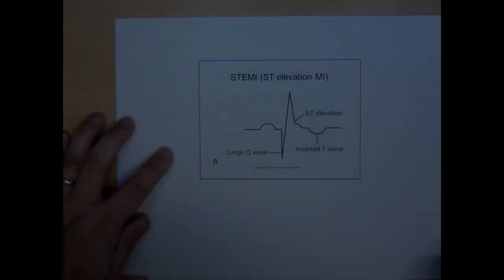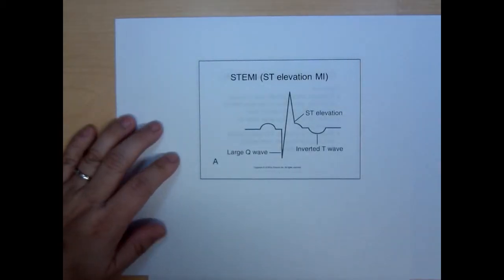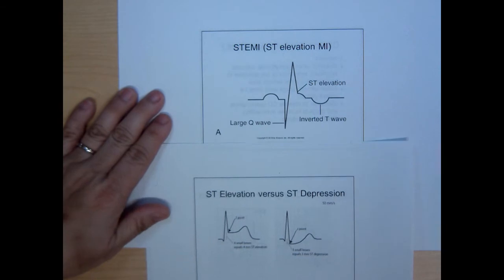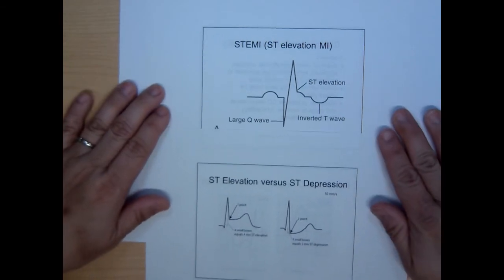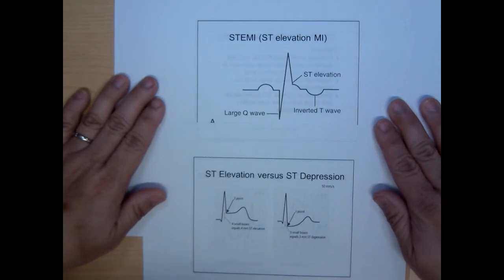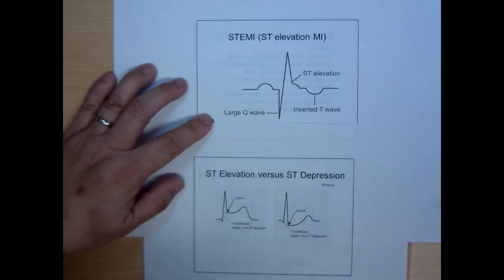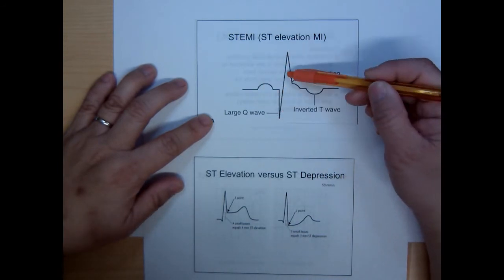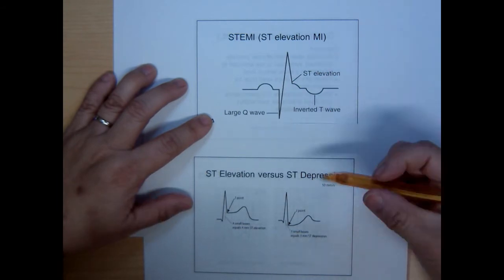Okay, class, we need to talk about EKG waveforms. First things first, in an ST elevation MI, we're going to look at actually two different things here, so just hang tight for a second in the window. Look at ST elevation MI at the top here. Here's a P wave, QRS, and then you have an ST segment and then a T wave. Two different things.